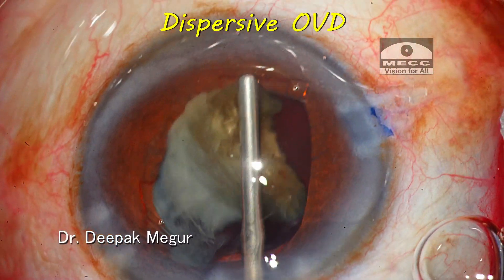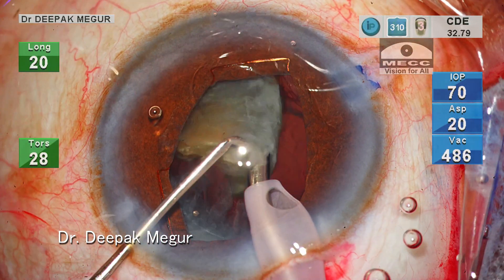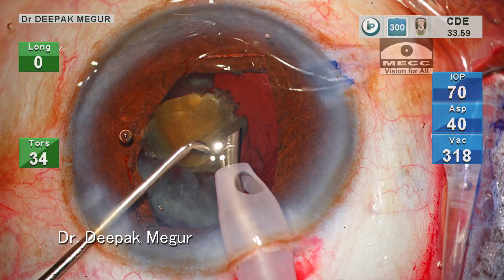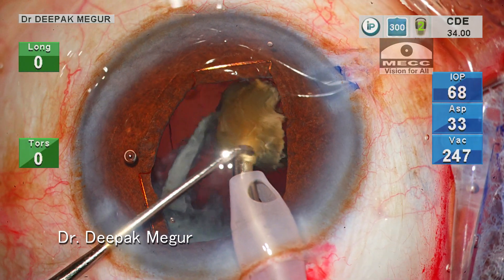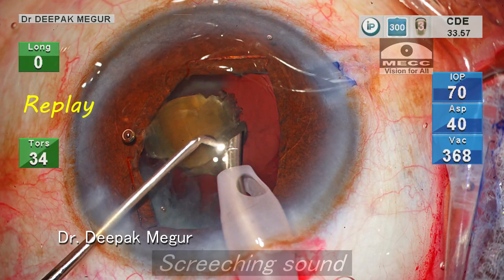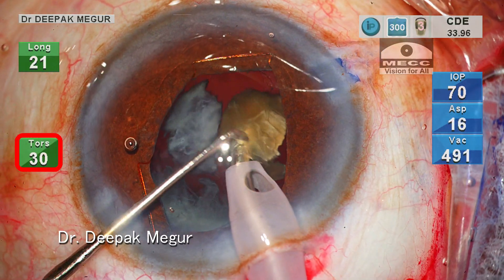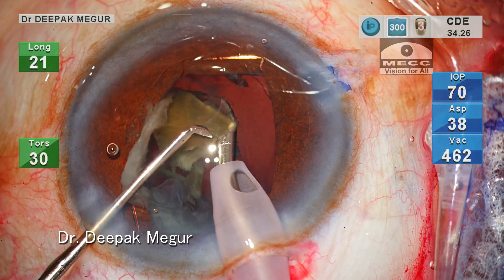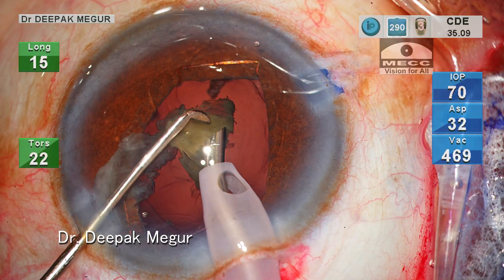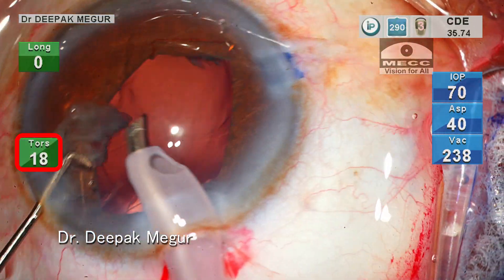Now moving on to the last fragment. OVD is again put inside the chamber. The fragment is engaged onto the tip and all the maneuvers are being done at the pupillary plane. Since the pupil is small in this case, we can appreciate the nucleus fragment dancing around the phaco tip, but most of it is happening behind the pupillary margin. Since my chopper is held very close to the phaco tip, occasionally it does touch the phaco tip — we can hear this screeching sound occasionally. The only secret to control the plane of emulsification is to slow down the speed of emulsification. By controlling the energy delivery via the foot control we can slow down the speed, ensuring the fragment always sticks onto the tip and dances around it, resulting in emulsification at a much more posterior plane with minimal trauma to the endothelium.